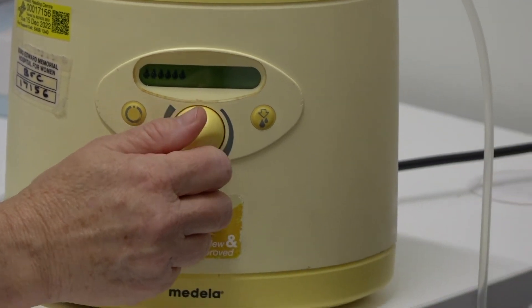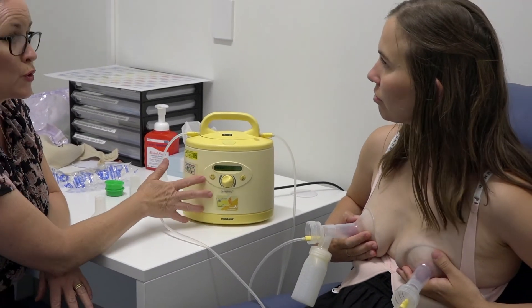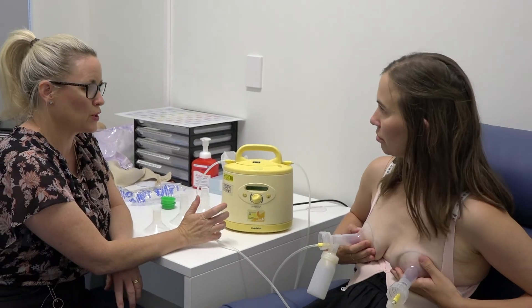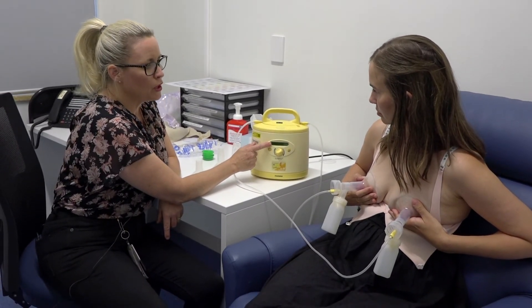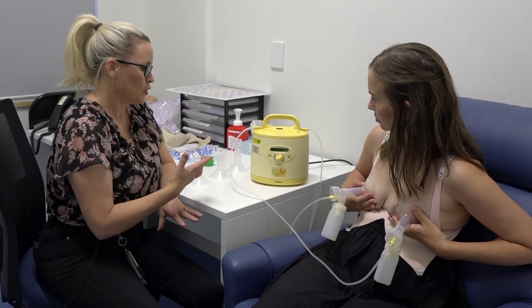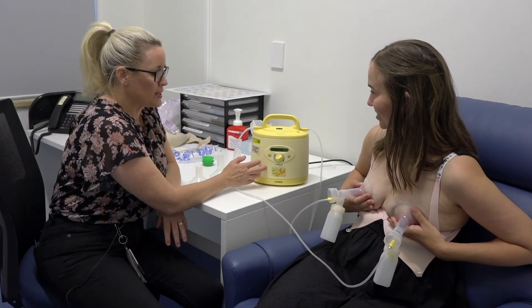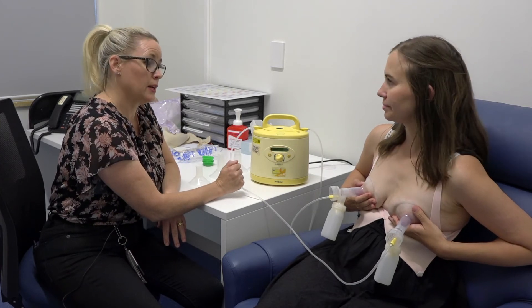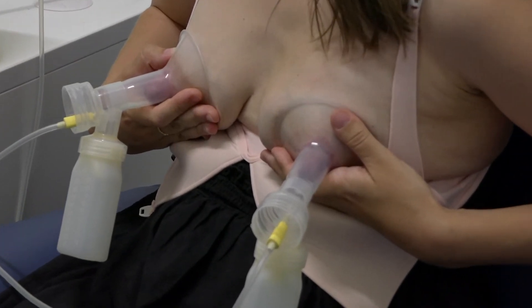We're just slowly turning it up, waiting for you to get a letdown or for the milk to start to flow. If I do nothing, this pump will do the stimulatory sucking action for the first two minutes and then automatically switch over to a longer, stronger sucking action — what we call the extraction sucking action — to get the milk out. When that happens, the little milk drop symbol will change to a bar symbol. If you get a letdown very quickly, you may not need to stay on stimulatory for the full two minutes — you can switch over to extraction sooner. We can see both breasts are starting to have a little letdown now, so we're getting milk to flow.